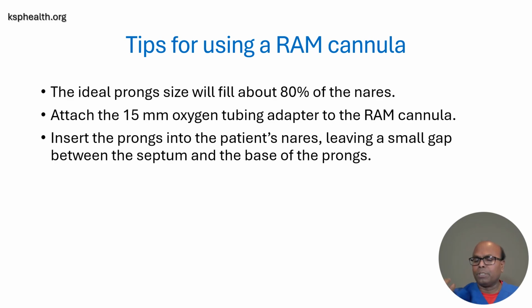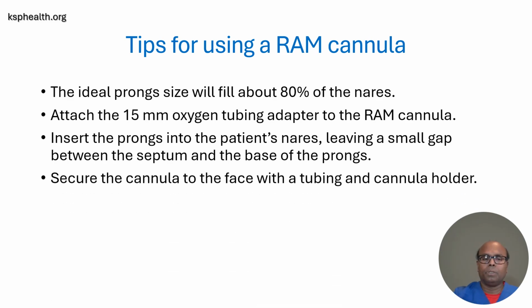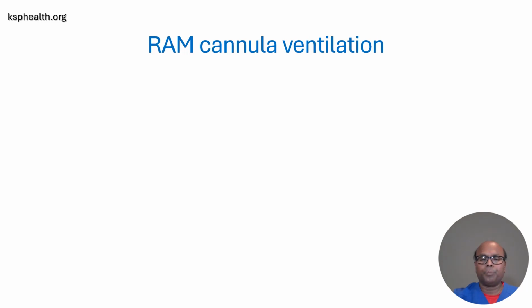Two complications can happen with the RAM cannula. One is septal injury and another one is skin injury. Secure the cannula to the face with the tubing and cannula holder, as I had shown you in the previous slides.